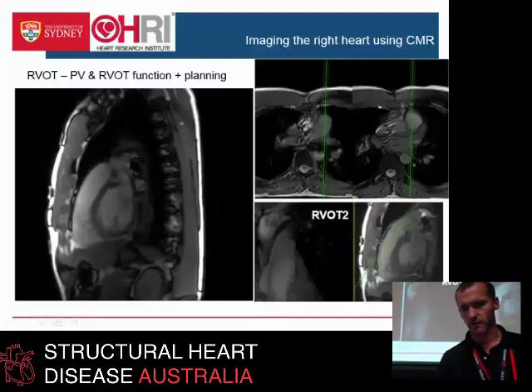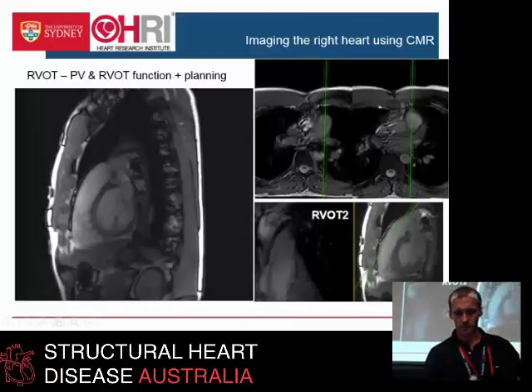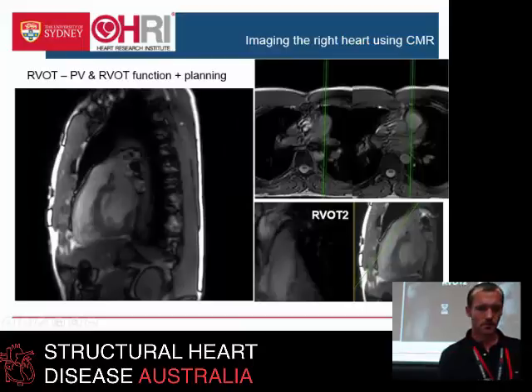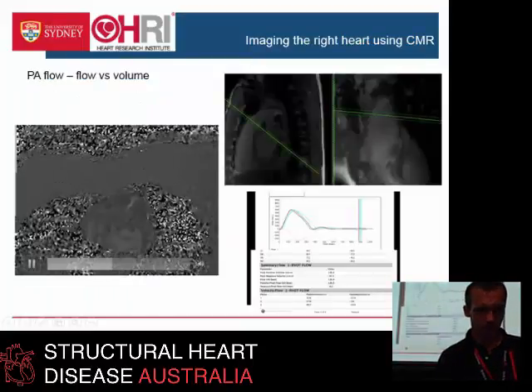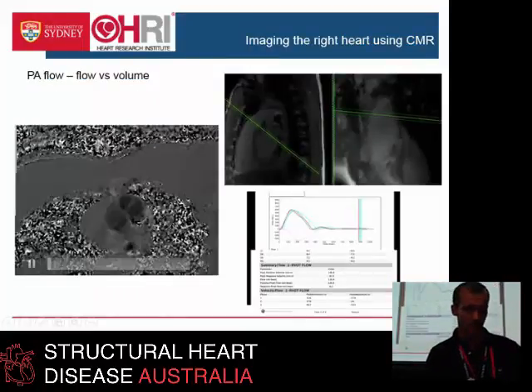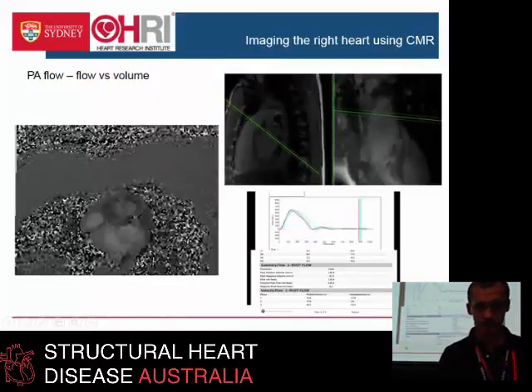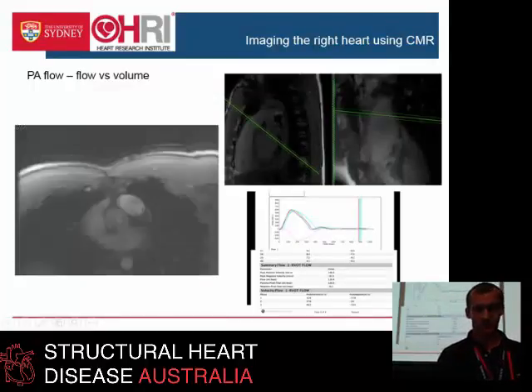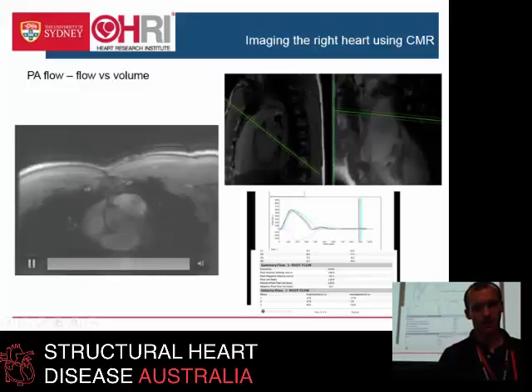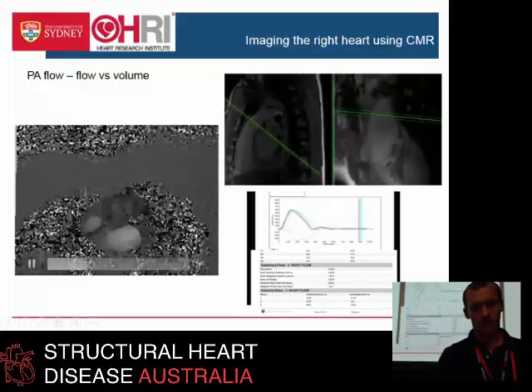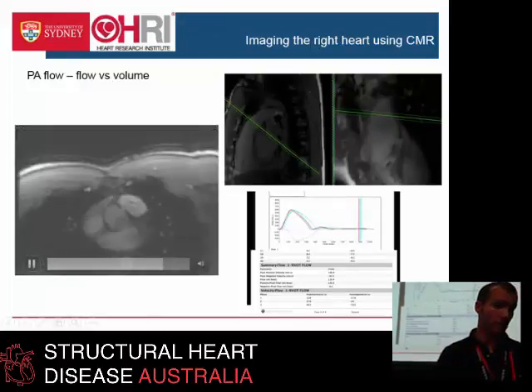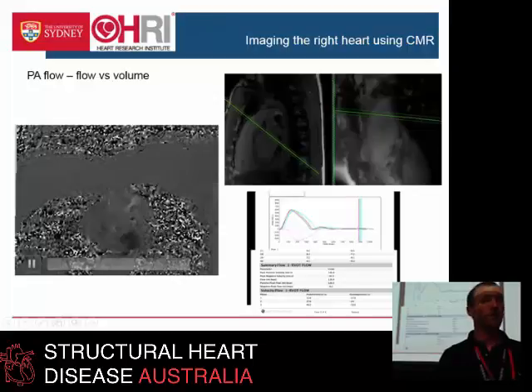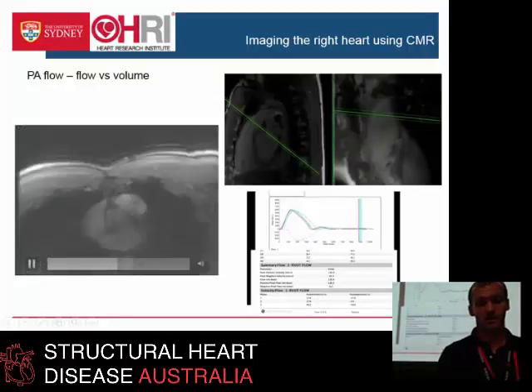Here's an RVOT view - I've just gone bang up, perpendicular to that. We take the RVOT and the RVOT2 and make sure our slice for measuring the pulmonary artery flow is perfectly perpendicular to the flow, which is really critical for flow quantitation.